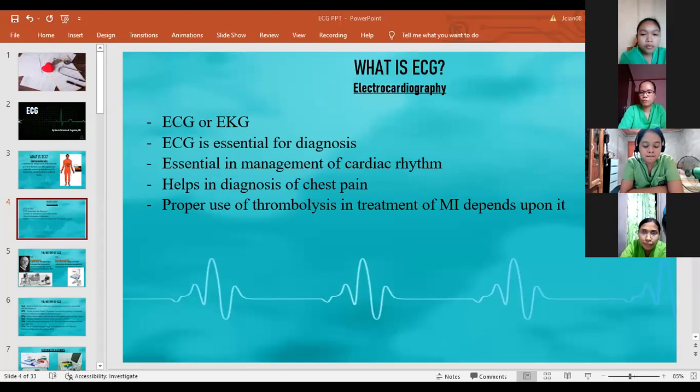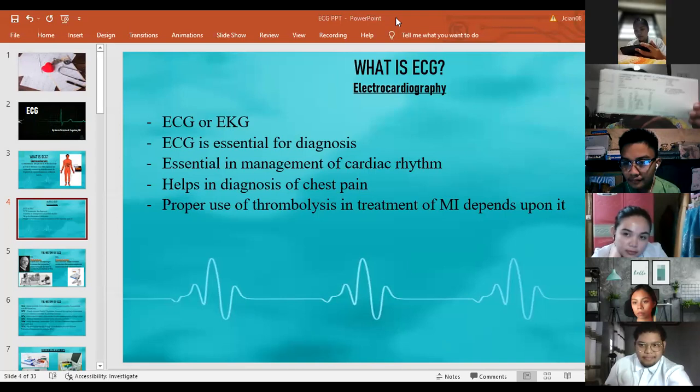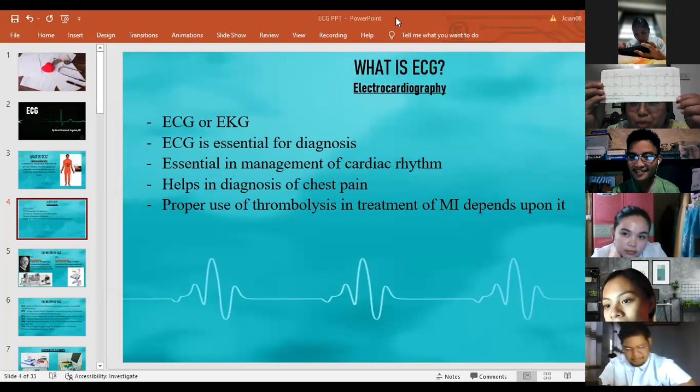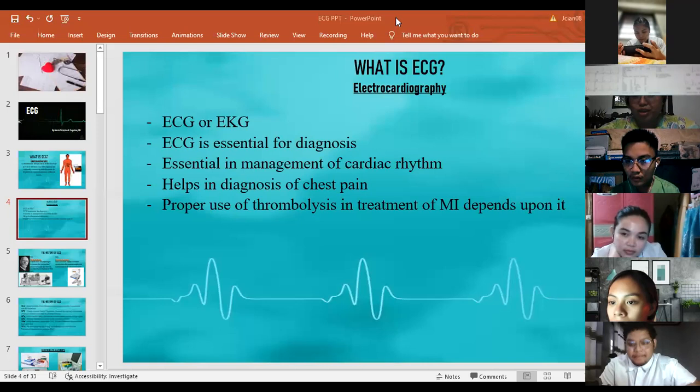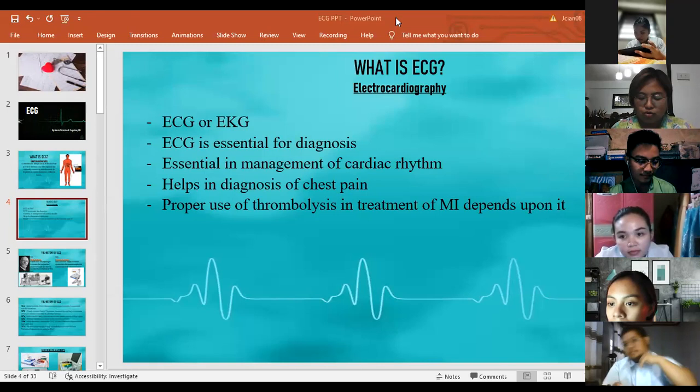So, ang ECG kasi, ginagamit lang po siya for, ito, ayan ang ECG rhythm. Nanghiram pa ako ng ECG sa hospital namin, doon sa dati kong pinag-work. Sa RHU ako ngayon, pero pumunta pa akong hospital para lang magpa-ECG. Ini-ECG namin yung boyfriend ko. Ang totoong ECG strip ay ganito kahaba. Tuturo ko naman sa inyo mamaya. Kung face-to-face nga lang, ipapakita ko sana sa inyo in real life. Pero pinicturean ko to.